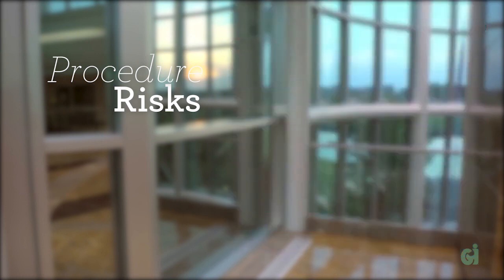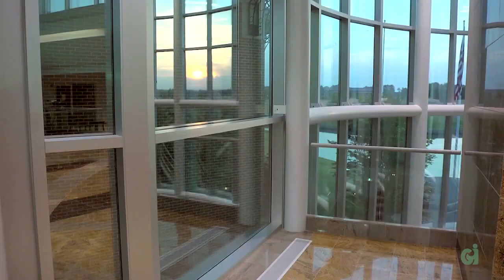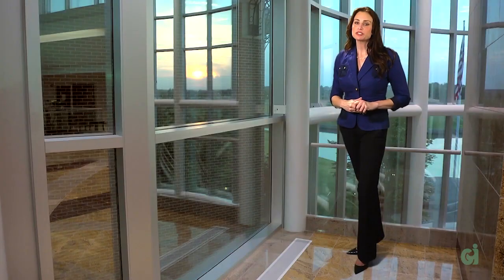Extremely rare risks include death, brain damage, disfiguring scars, paralysis, loss of function of an organ or limb. Because sites can be examined directly, EGD is considered very accurate. Most doctors consider the results cost-effective with the least risk. However, there are alternatives such as barium X-rays and scans.